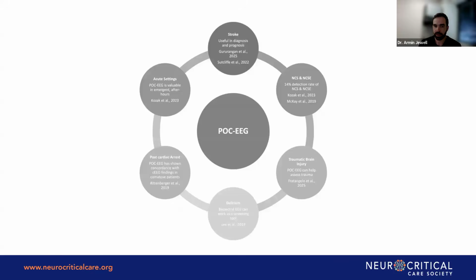This again, the summary that we went through, these 6 different components of it that are currently the main uses for point of care EEG. Some well established, some more on the up and coming side, but it kind of shows that there is use in different ways for point of care EEG.